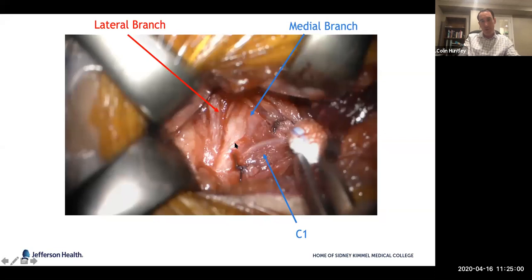So this is that medial branch and lateral branch that we're talking about. These medial branches are heading to those protrusor muscles of the tongue that we're trying to include. And you see the C1 takeoff right here. Just to orient everyone, this is anterior, this is inferior, superior, and posterior. So you're seeing that proximal nerve coming in here and that branching pattern. And these lateral branches are the ones heading off to the styloglossus and hyoglossus. So we're going to end up trying to place our cuff right along here and exclude that branch right there. That's probably a late protrusor or late retrusor.